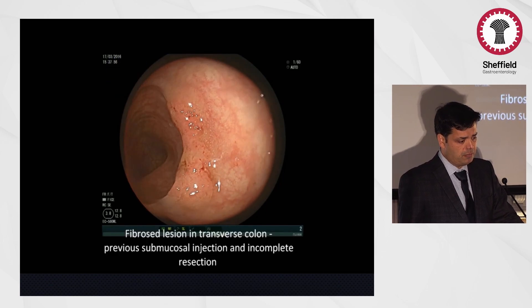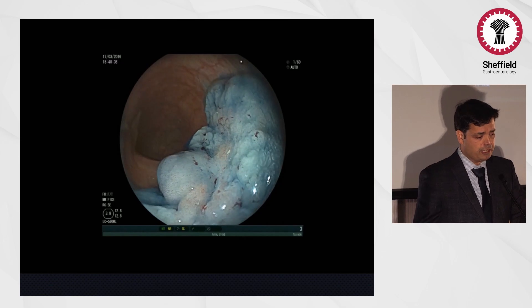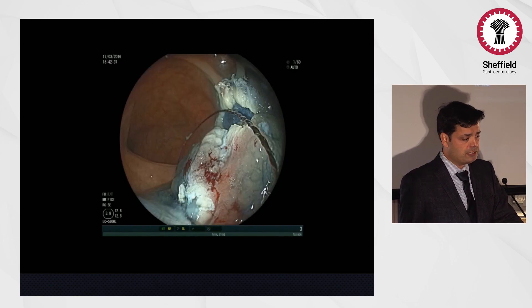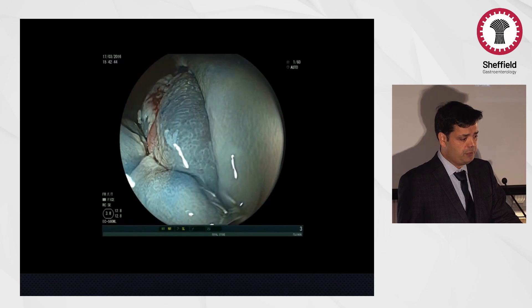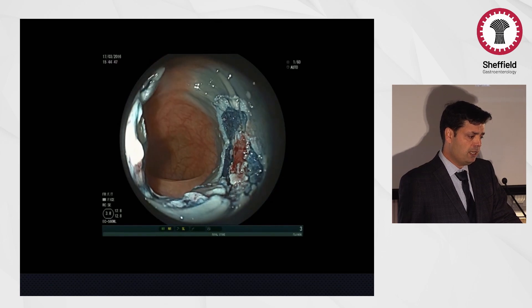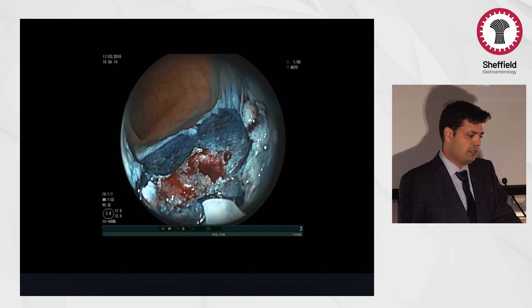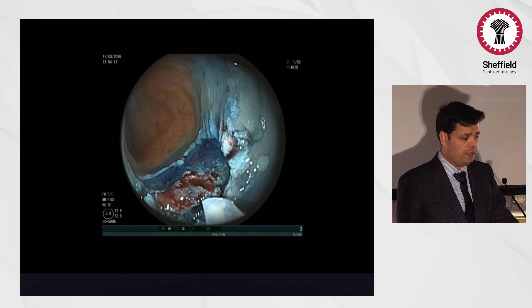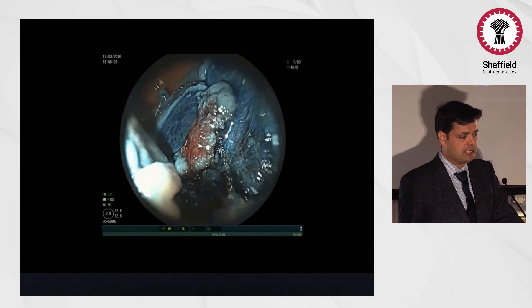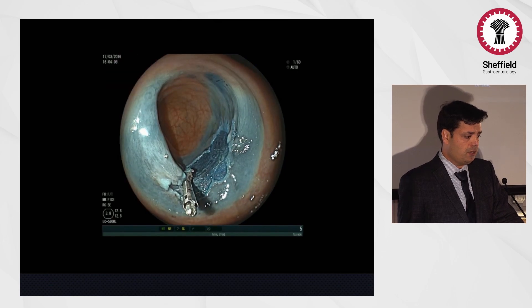This was a lesion where a previous EMR had been attempted and was incompletely resected. The central part is completely scarred — this is not a cancer. The peripheral areas can easily be engaged with the snare and resected, but the central scarred part is very difficult to engage. Here I'm injecting underneath the center. This is a benign lesion, so I'm not worried about taking it out in one piece — just using the tip of the snare to help engage the snare in the groove, and it had a good outcome.